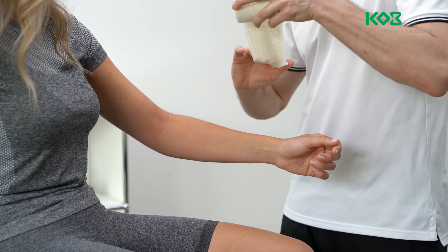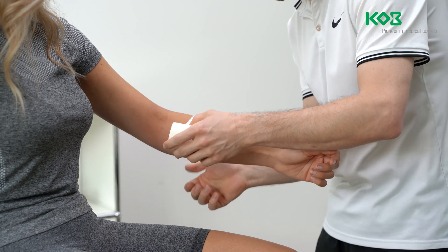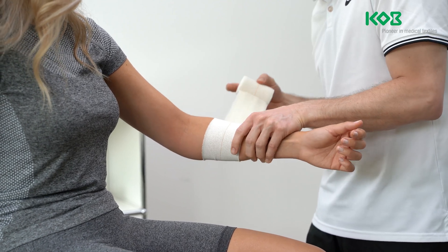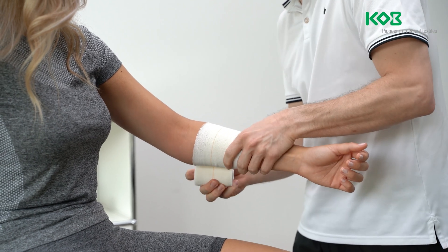Unroll the bandage a little before application. Apply the bandage to the affected side with moderate tension. The elbow is slightly bent. Start by applying the dressing below the elbow joint and apply several laps moving up to the middle of the upper arm.